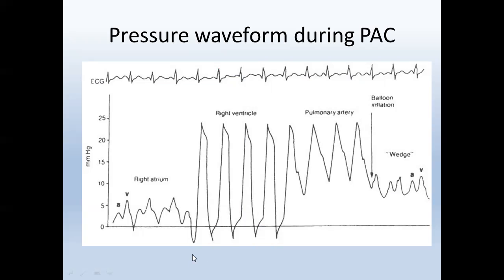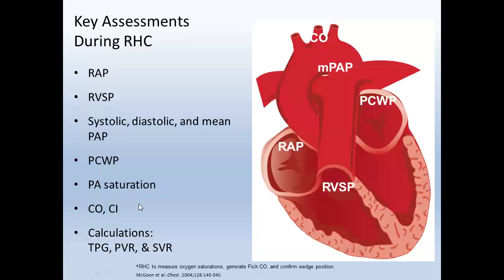When you take measurements for atrial pressure, people always ask, what is the A, what is the V, what is the mean? Don't go by the computer-generated mean, because for A, it's actually the mid-A. For V, whatever is the peak is the peak. And for the mean, don't go by the computer-generated mean, because if somebody has severe TR, their V wave is going to be 40, and the computer is going to average and give you a higher pressure. So what is accepted in the community is that the mid-atrial A will be the mean A wave. And that's what I do.